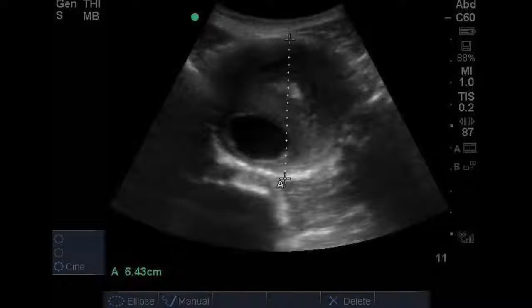If you do have the pathology, you want to visualize it in 2 planes, as you may be able to identify key points of the pathology and certain measurements easier in one plane compared to another.